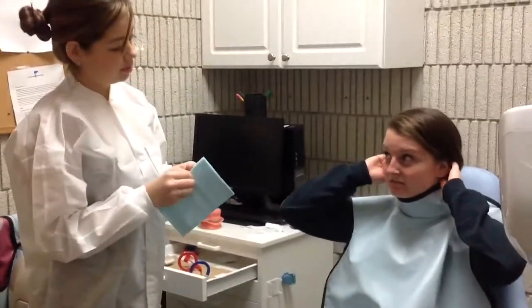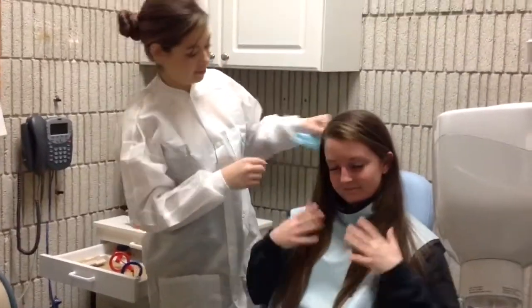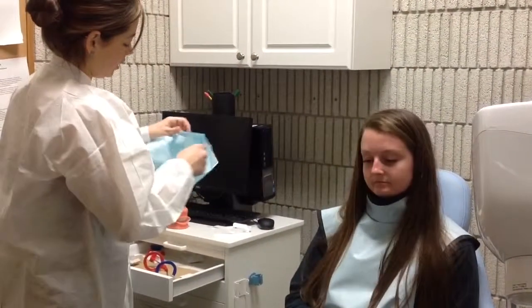Can I take my hair out? Sure. I know it's a little uncomfortable. Yeah. There we go. Okay. Is that better? Yeah. All right. Let me just take this a little bit more. Perfect. And I'm going to give you a little bib.